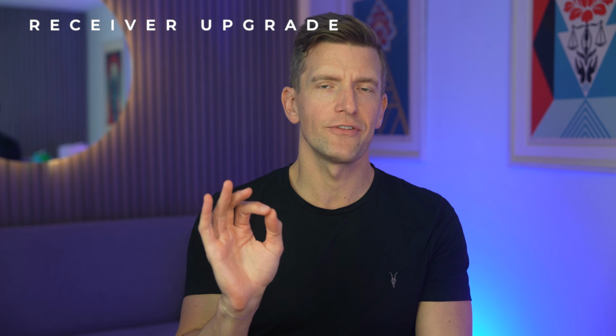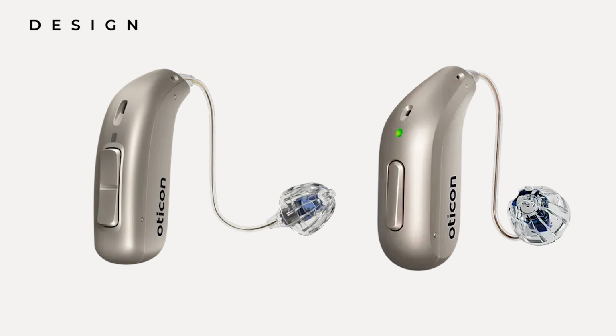Whilst I'm on the subject of receivers, I should also share Oticon's info on their recent upgrades. Oticon are boasting that they've improved their brand new receivers in 3 different ways. Firstly, in design. So they've changed the angle of the bend, as you can see here, when compared to the Oticon Real on the left and having the Intent on the right. Having seen them in plenty of ears now, I can say that they sit a lot better, following the contours of the little valley above the tragus and making them seem that little bit more discreet. Not that this was a huge issue before, but I'm happy with these marginal gains of improvement.